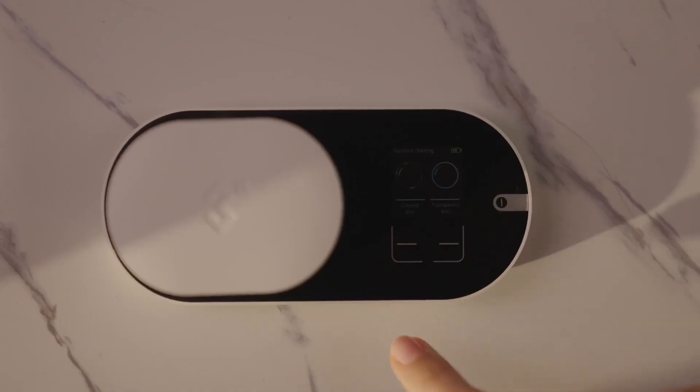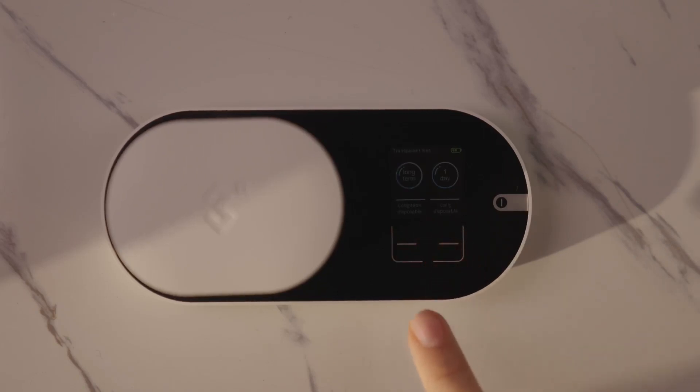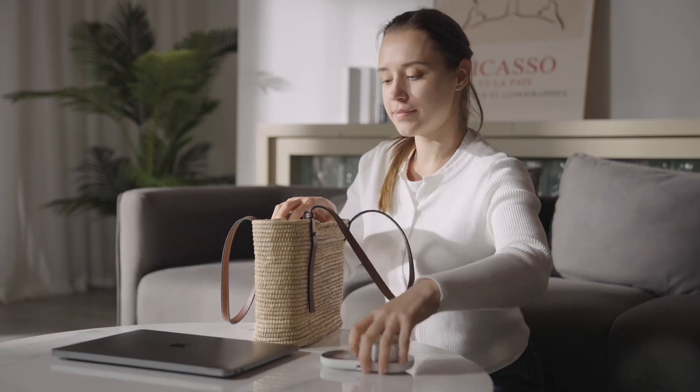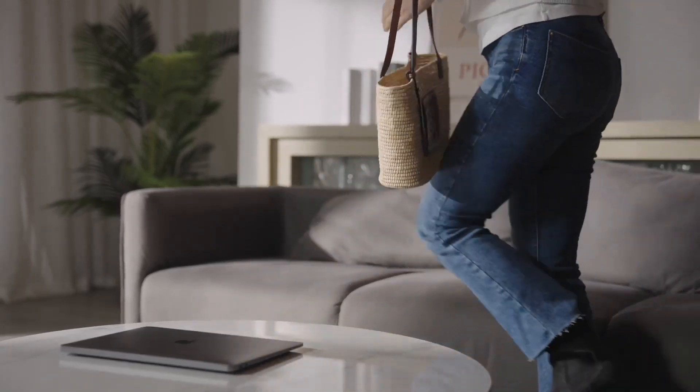There are different modes for taking care of your contact lenses, whether you are using clear or coloured lenses, daily or long-term contact lenses. ReO2 is super light and you can carry it with you in your bag or on short-term travels. It only needs to be charged once for 30 days.